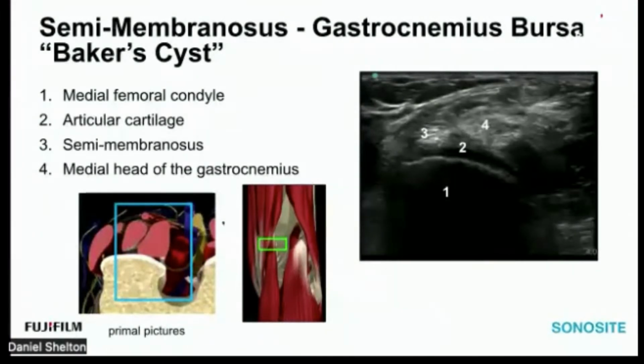So we're taking that slice about where this diagram says we are. And you can notice that the tendons proximally are diving down deep, mostly to insert on the posterior tibia, the semimembranosus, for example. Superficial to that is this one little dot right there, and that's the semitendinosus, which we don't talk about in the slide so much, but we'll image it when we're trying to identify all the little circles on the screen. And then coming in from distal to proximal is the medial head of the gastroc, and they scissor right here, and I'll show you that in the live scan, what I mean by the scissoring. And that's where this Baker's cyst protrudes from the joint and gets trapped between these two structures, and it acts like a valve. Excess fluid in the knee joint can leave the knee, but it gets trapped and it can't go back in.